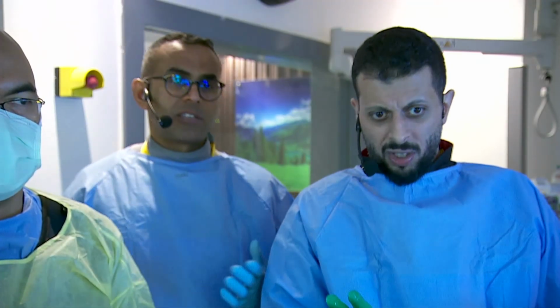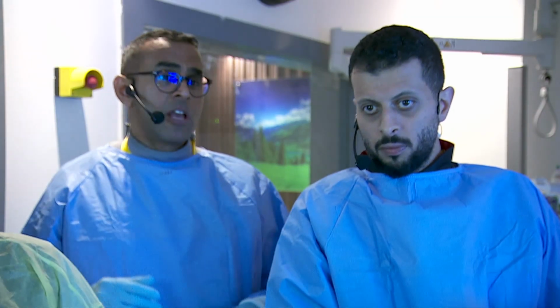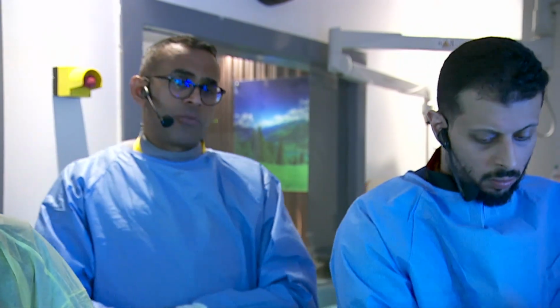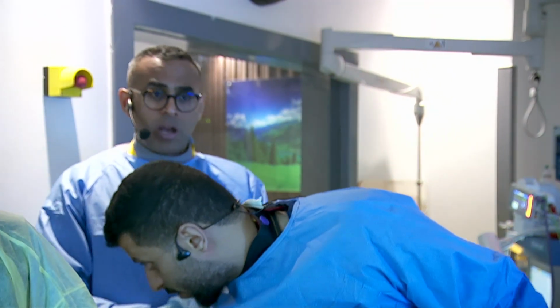So they come in different sizes. They have a large portfolio in different sizes. Of course, when you talk about pancreatic stents, you're talking about 5 French. They may range from 4 to 5 centimeters. When you talk about the biliary stents, they can be like 7 French or larger.